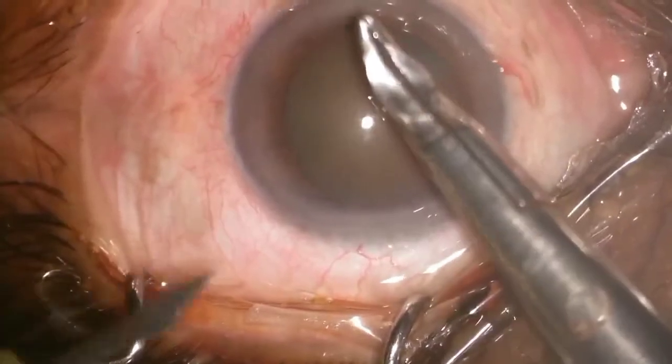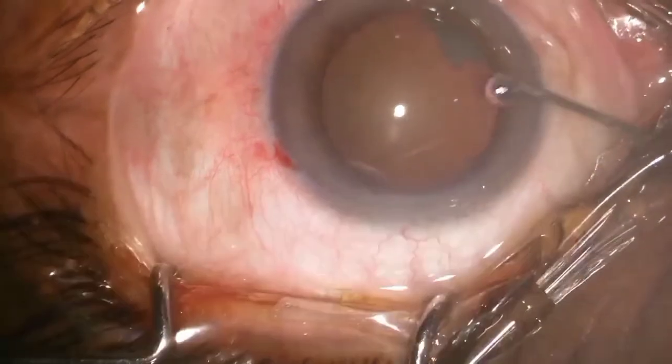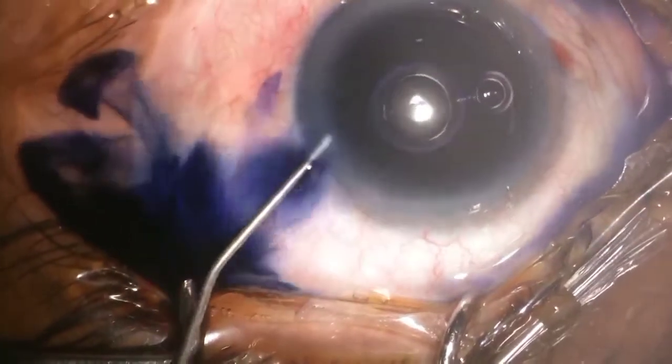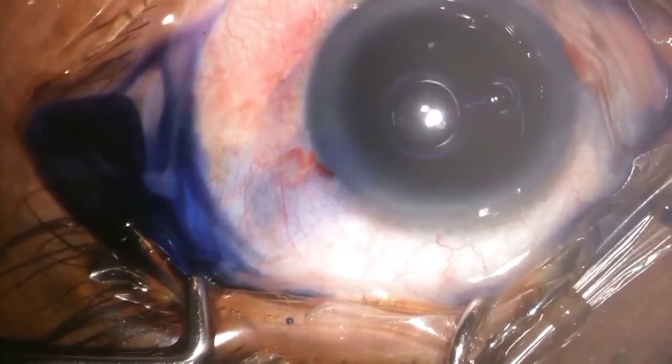Because it was an NS4, around brown cataract, the patient was diabetic, and as you can see, the pupil was also mid dilated. The patient was having a low platelet count and was also on a blood thinner agent, so it was impossible to give her a block. So I decided to do the phaco surgery in topical anesthesia.